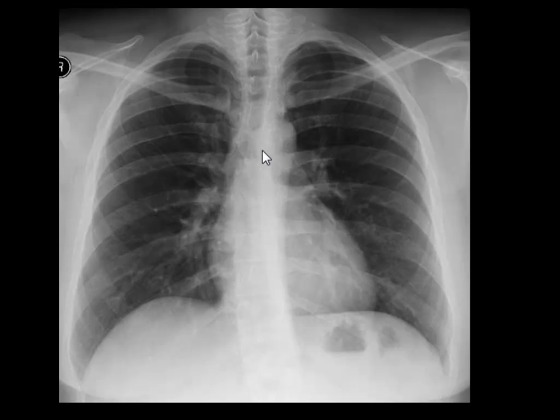Such clots can cause infarctions, meaning tissue becomes dead. Pulmonary infarctions on chest x-ray can easily be confused with consolidation, although very frequently infarctions caused by pulmonary embolism have distinct features such as triangular shape and peripheral location. Vasculitis is another condition of vessels. Then you have pleural space conditions such as pneumothorax, hemothorax, pleural effusions, pleuritis, and so on. Thank you very much.